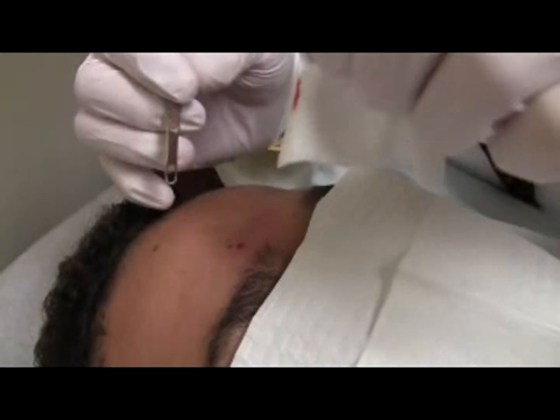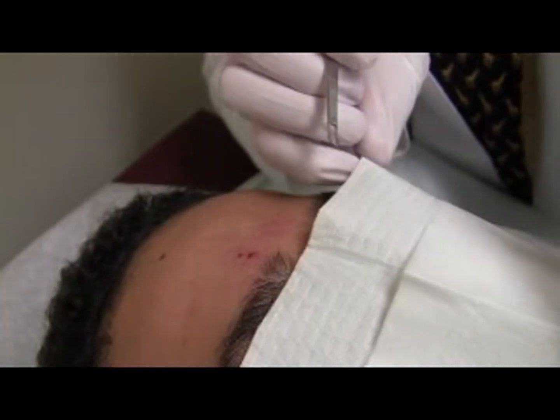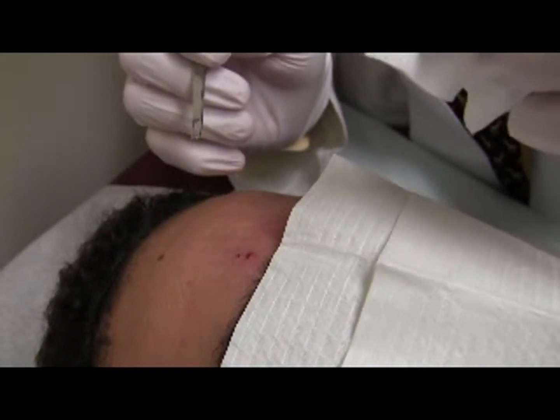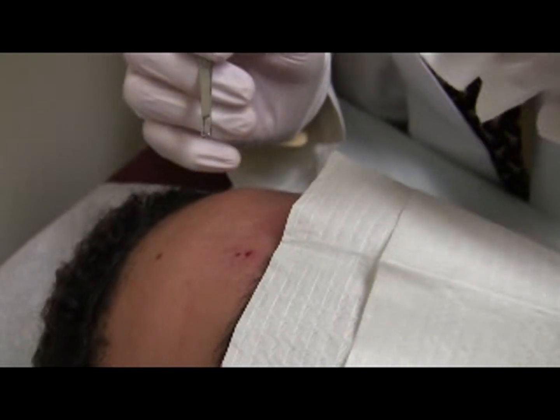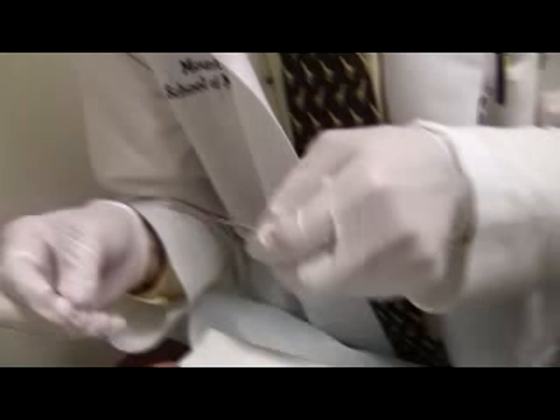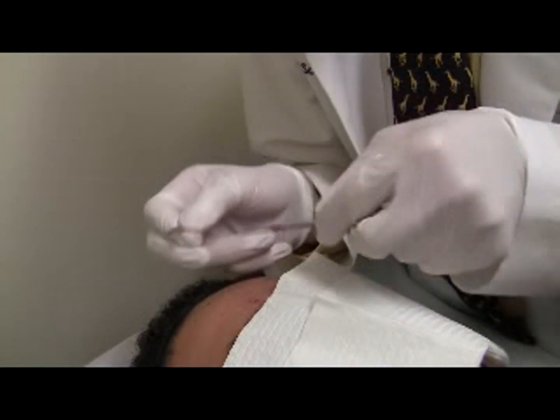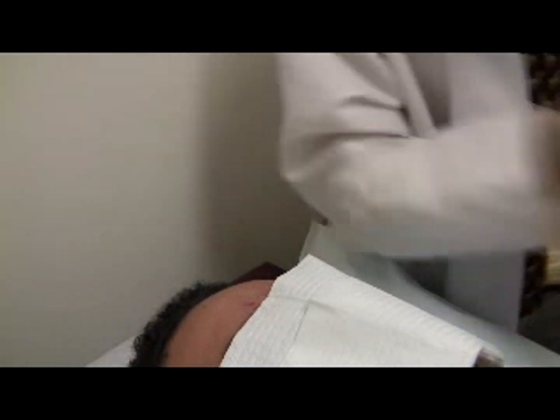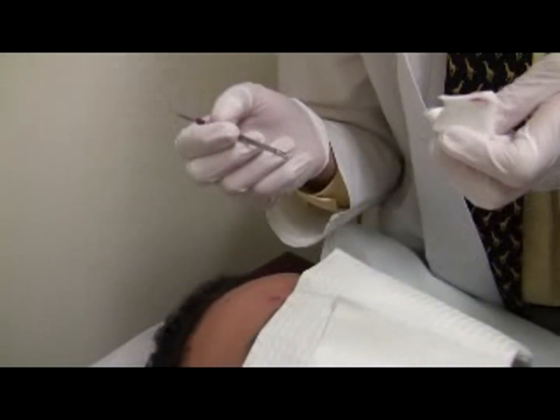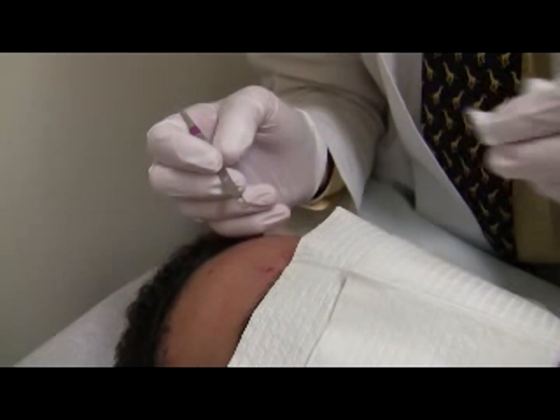If your left hand is only focused on the bleeding and not on the blade, you can stick yourself. Some may feel it is intuitive to hold the comedone extractor and the 11 blade in either hand at the same time. However, in switching hands simultaneously, your left hand focuses on giving the extractor rather than receiving the 11 blade. The result is a laceration or stick.